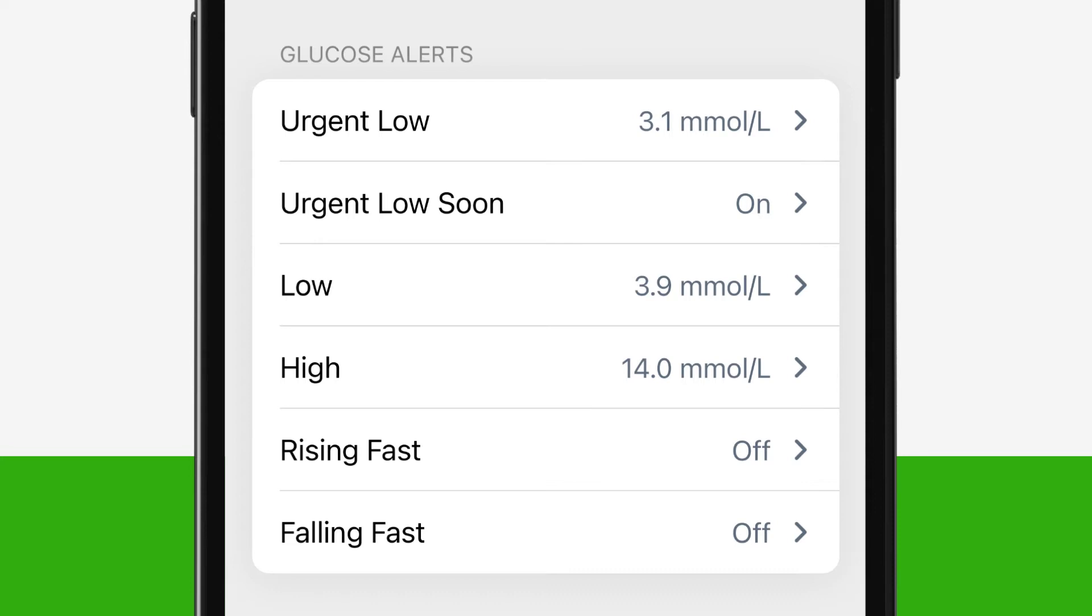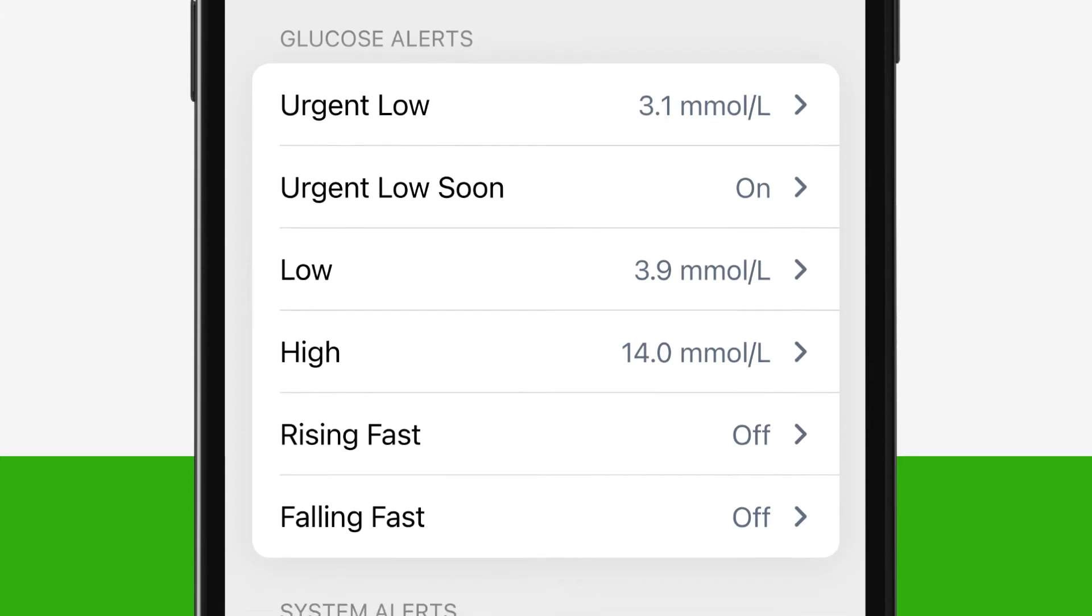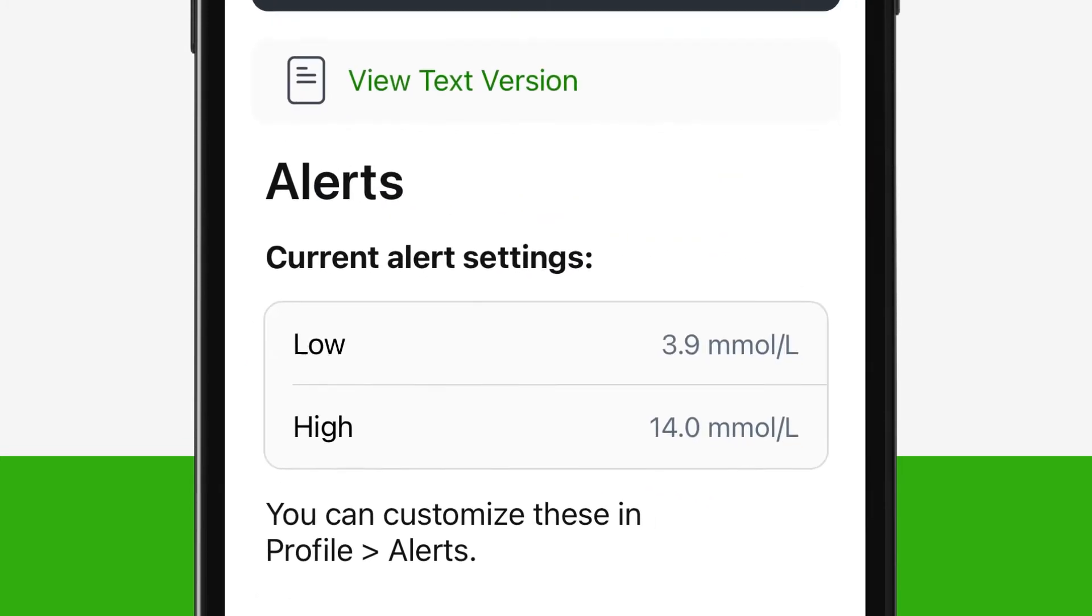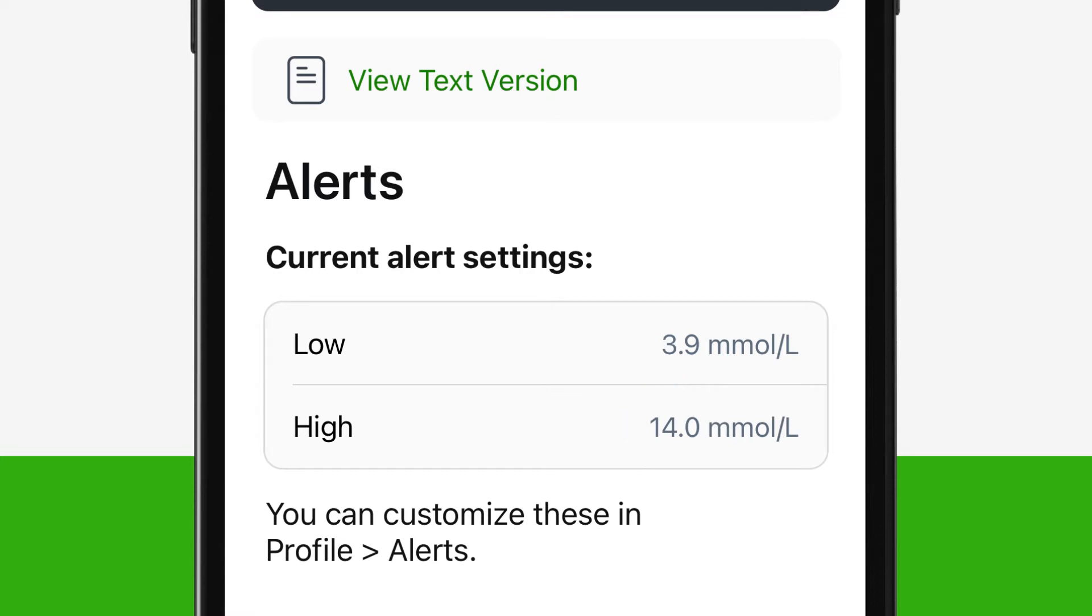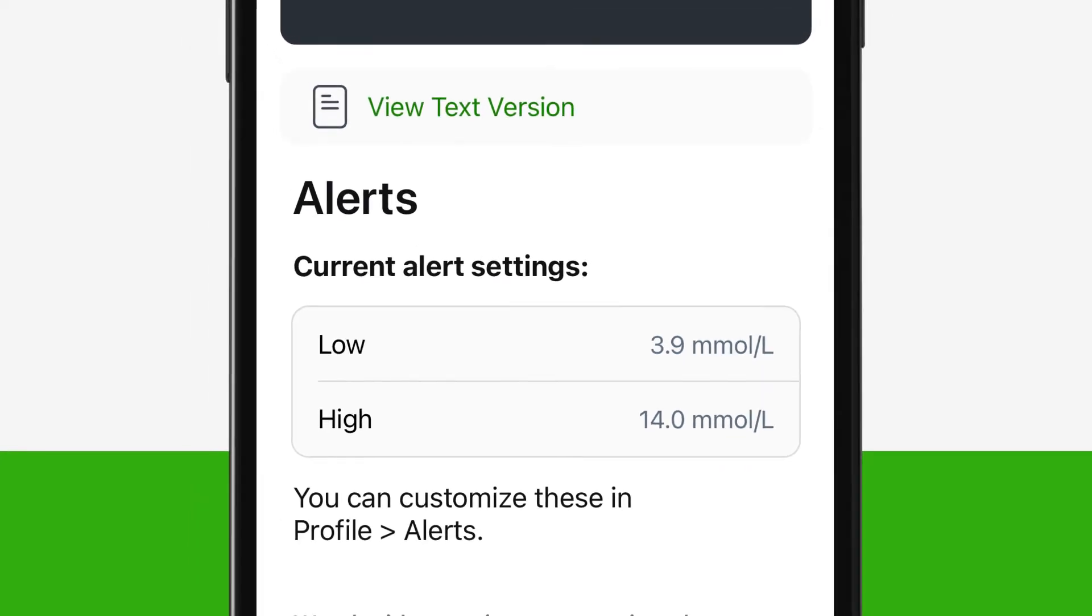First, let's start with the low and high glucose alerts. During setup, you will see the low alert is set automatically at 3.9 mmol per litre and the high alert is set at 14.0 mmol per litre. You can customize these to your personal needs.